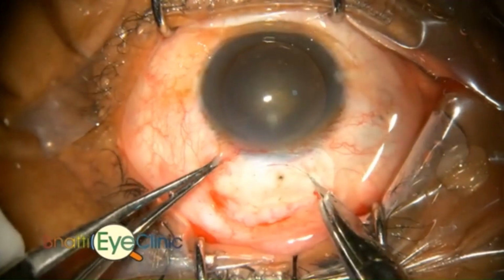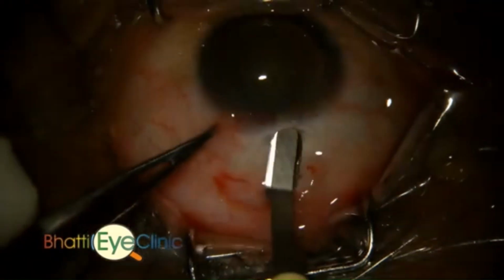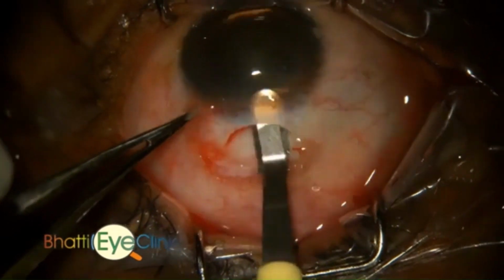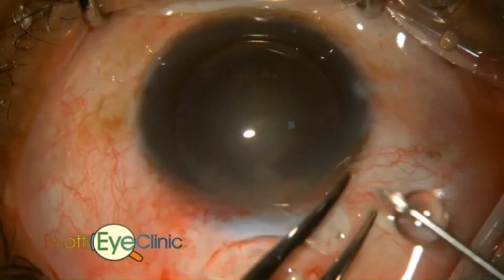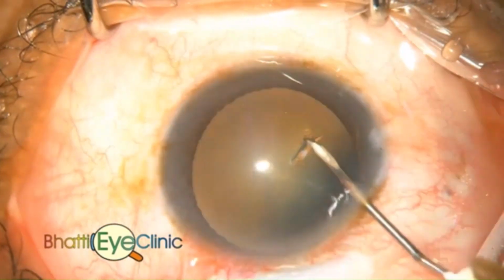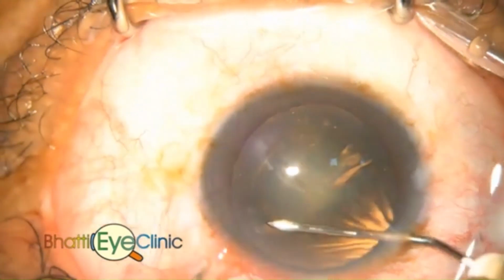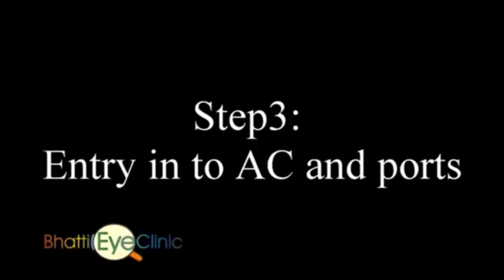Now, that is the incision on the sclera. Next, the crescent is being used to make the sclerocorneal tunnel with side pockets. The next step, a continuous curvilinear capsulorhexis is done with the help of a cystitome, which is a bent 26 gauge needle. That's a beautiful CCC over there, about 5 mm in diameter.